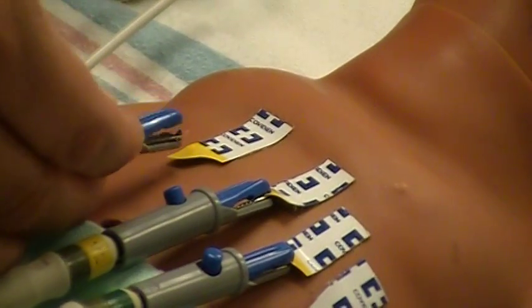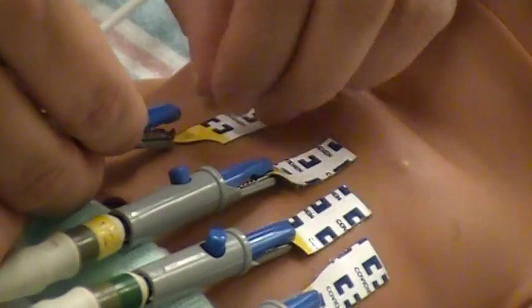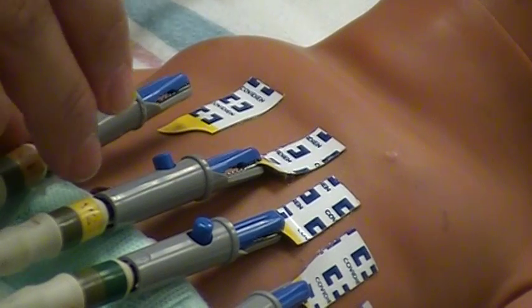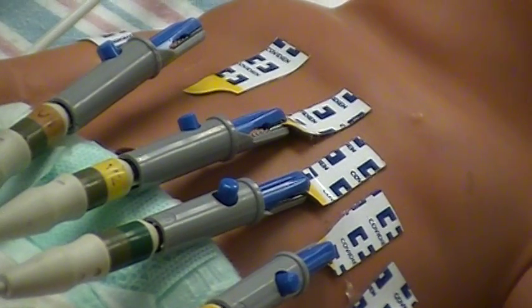The alligator clips need to be positioned correctly on the patient's chest. The blue part of the alligator clamp needs to be up. You can remember this as blue sky — blue goes up.